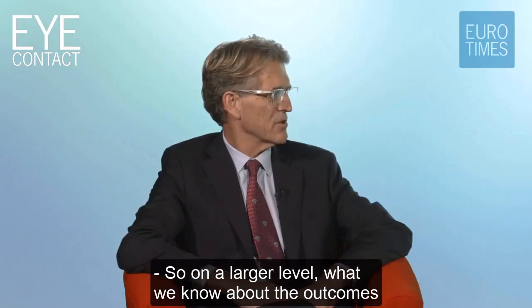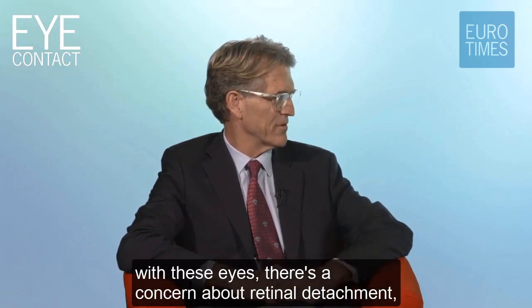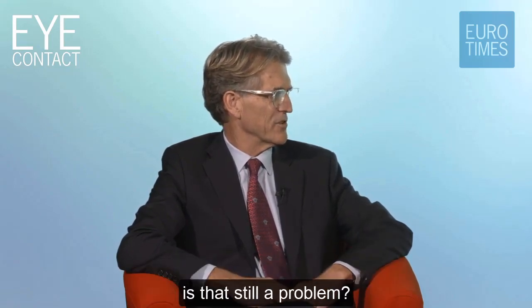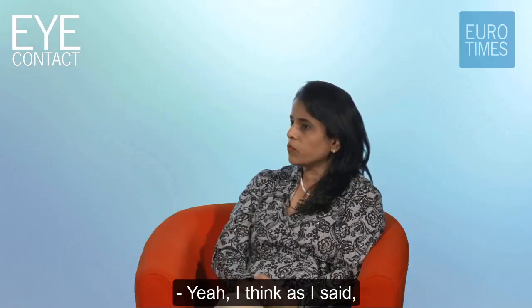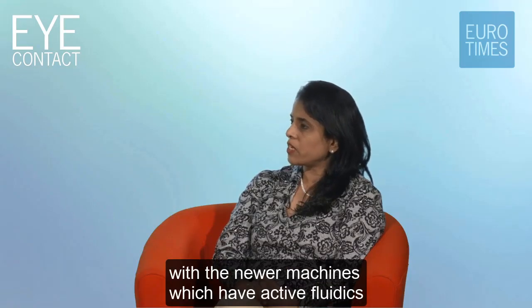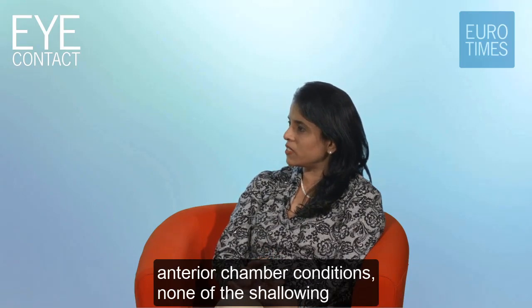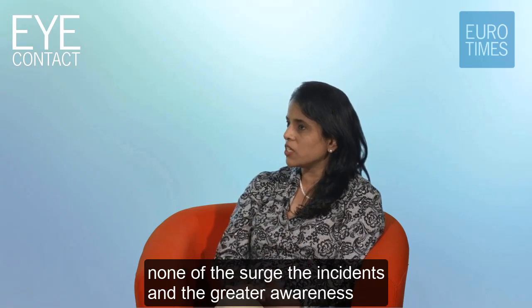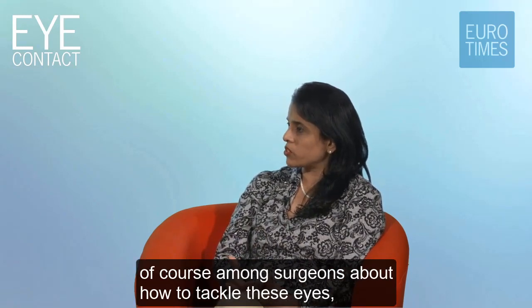So on a larger level, what do we know about the outcomes with these eyes? There's a concern about retinal detachment. Is that still a problem? Is it less of a problem than it was? Yeah, I think as I said, with the newer machines which have active fluidics and are very stable, you get extremely stable anterior chamber conditions. None of that shallowing, none of the surge, and the incidence is lower, and there's greater awareness, of course, among surgeons about how to tackle these eyes.